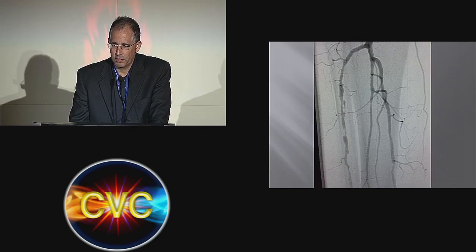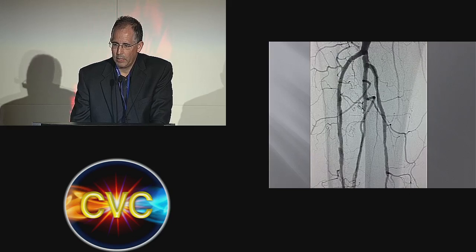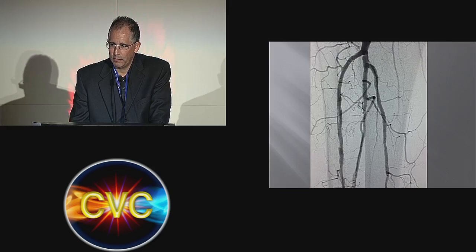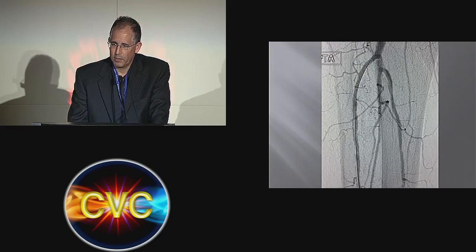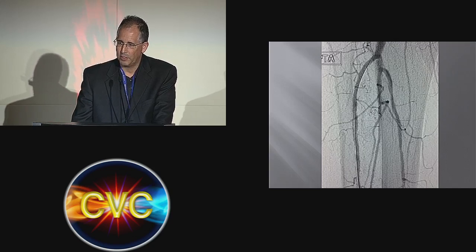So this is a picture of the artery before I treated. Oops, let's see, did I not hit the button? There is after atherectomy, and then there is the following the final balloon inflation. Sorry, the patient's leg moved a little bit, and I did the best I could to adjust it.